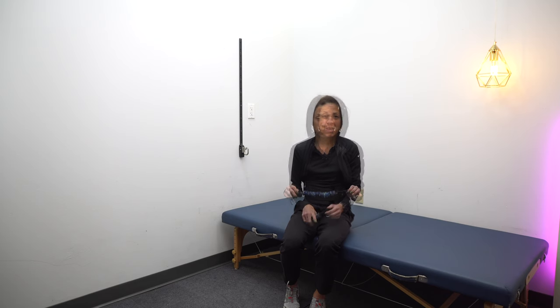I've shown this product quite a bit on this channel in other videos where I'm demonstrating exercises to work on normalizing leg movement. Because I use this so frequently with so many patients to teach them how to do exercises on their own at home, I thought I would dedicate a video to showing you all the ways you can use this resistance band belt.